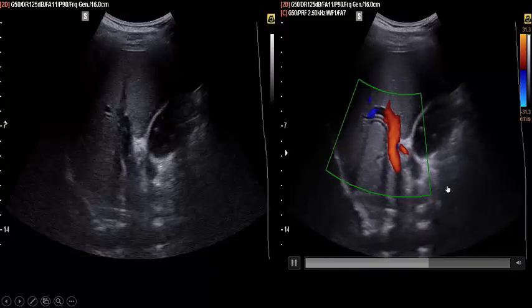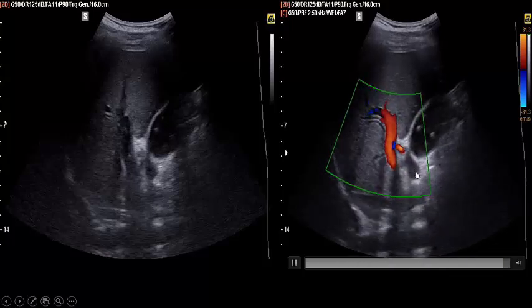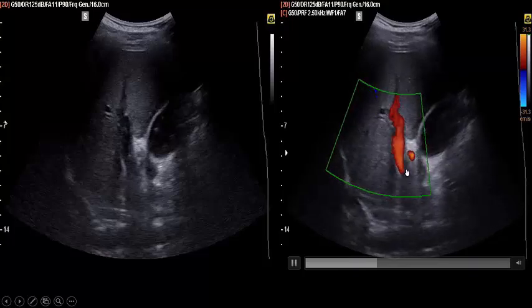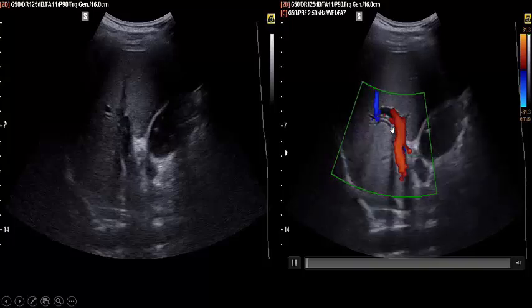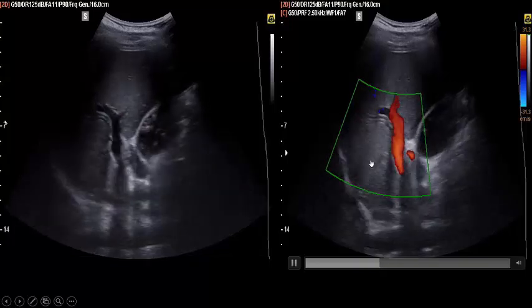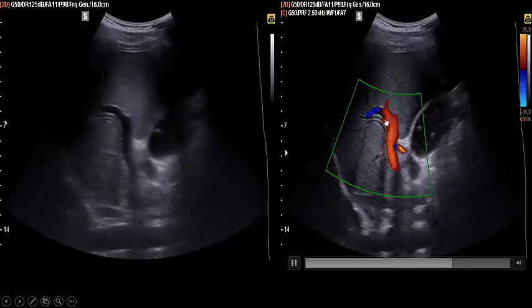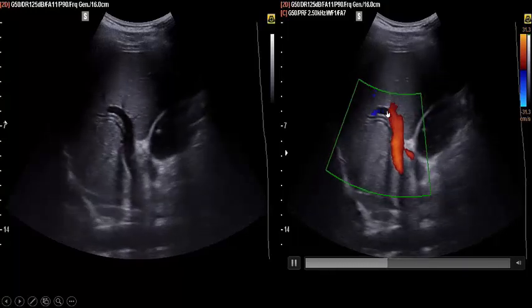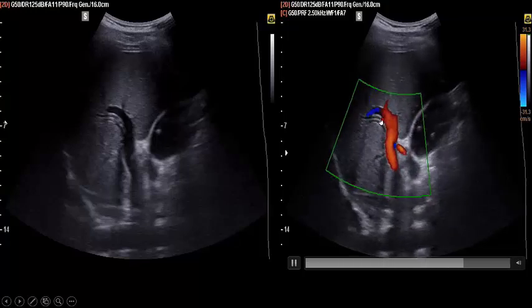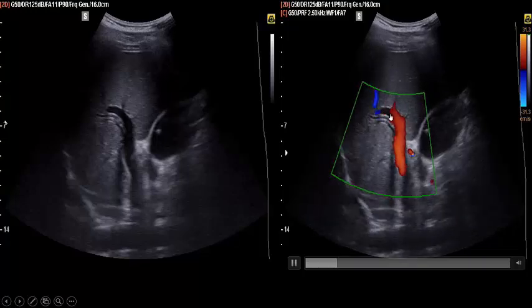In our patient, there are 3 tracts in the porta hepatis here. The common bile duct is anechoic with no color flow at all, hepatic artery pulsatile flow, portal vein continuous flow, and there is a very important point here in our patient. These intrahepatic tram tracts, I find here 2 tracts going with the right branch of the portal vein, flowing together, both taking the color.